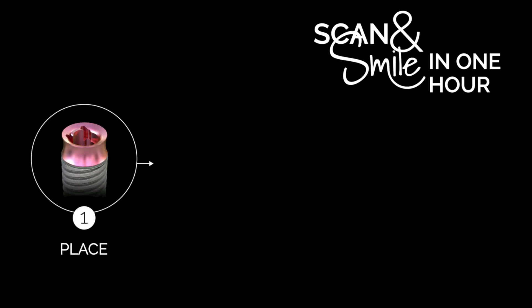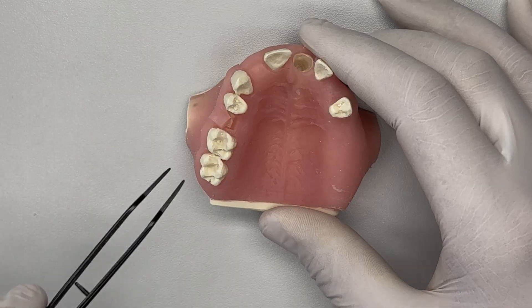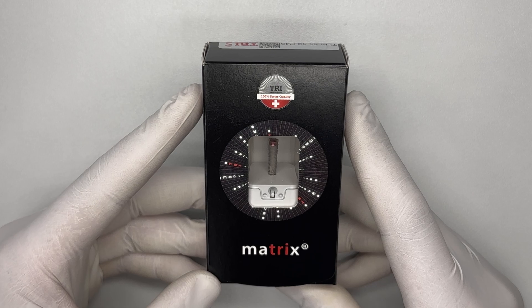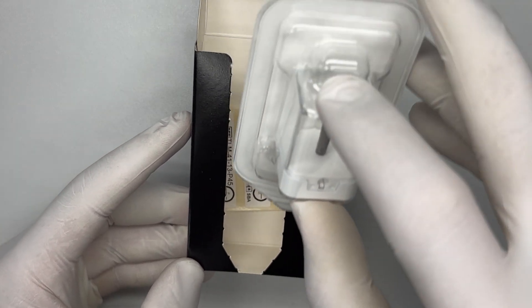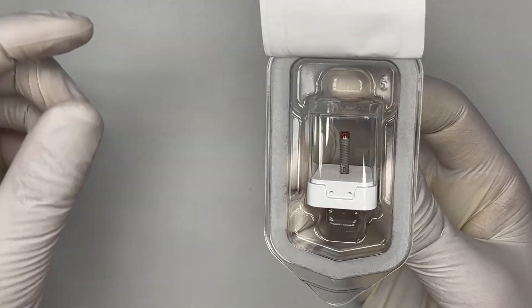Let's start with step one. Starting with a classical flap raise and prepare the situation for the implant placement. John will receive a multi-level Matrix Implant Platform P45 with a diameter of 4.1 millimeters and a length of 13 millimeters. To open the packaging, tear it from the bottom to the top. Take out the sterilized blister. Open the blister and simply drop the TRI pod on the surgical tray.